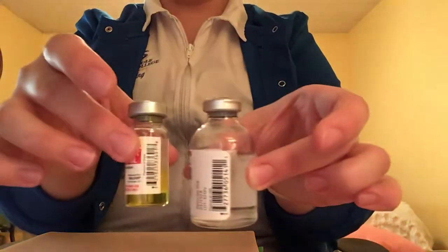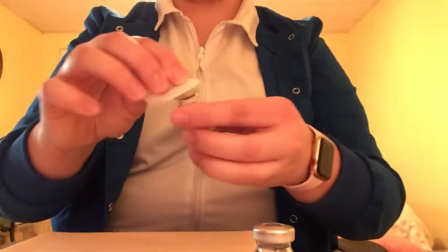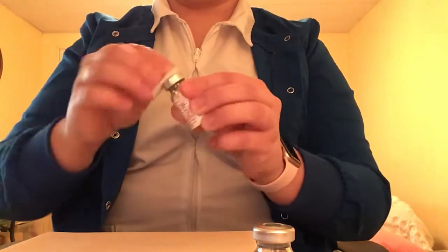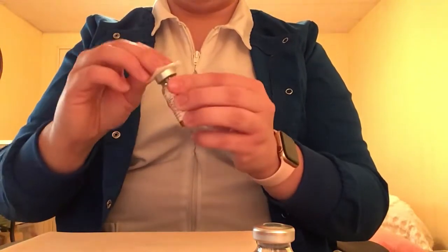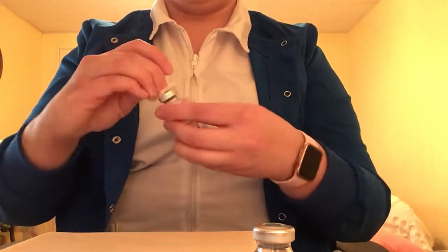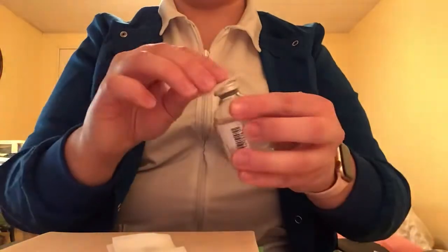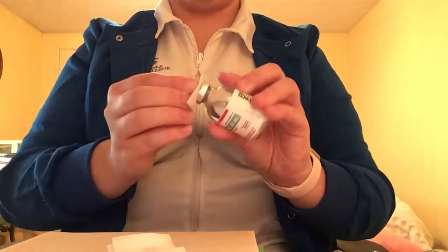Okay, so I have my two vials here, and the very first thing I'm going to do is take an alcohol pad and clean the center of the rubber stopper of each of these, and I'm going to make sure that I do this for about 5 to 10 seconds, so that way it is very, very clean. And I'm going to leave the alcohol pad there, so that way I know that I cleaned it. And I would do the same thing with this one here.